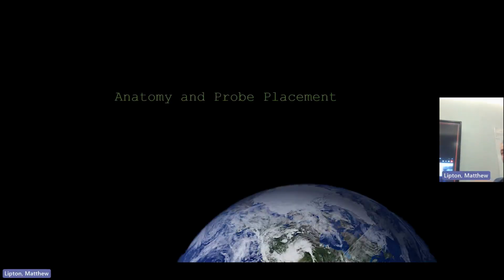DVT is going to be a little bit different for us in emergency medicine versus you guys in the ICU, because in emergency medicine, people are typically ambulatory and are coming in because their leg hurts and they want to know if they have a DVT. And so we are going to be performing a point of care ultrasound, which we will use in lieu of a radiology ultrasound, and we can discharge people home based on a negative point of care ultrasound. In the ICU, you guys are going to be using it differently.